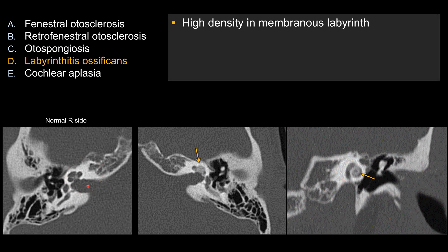If you compare it to the right side where the inner ear structures should be lucent, on the abnormal left side you can see the cochlea has abnormal density inside. The posterior semicircular canal also looks abnormally dense. On the coronal view, you see the spiral-shaped or snail-shaped cochlea is abnormally dense. That's the hallmark for labyrinthitis ossificans.